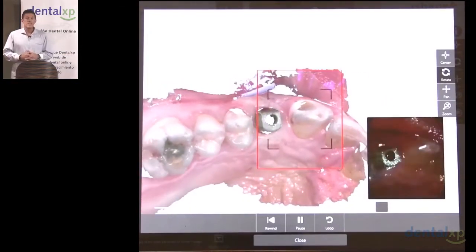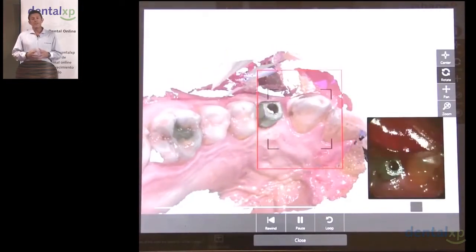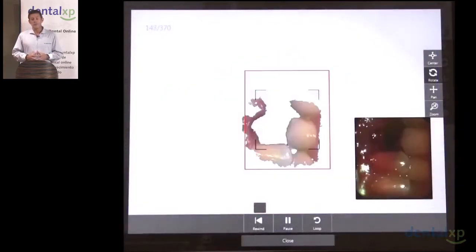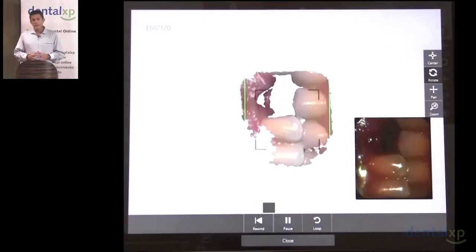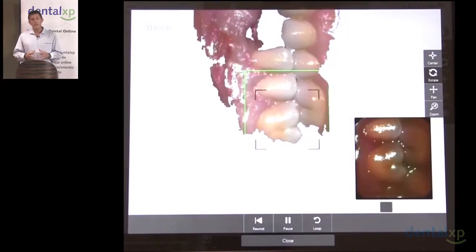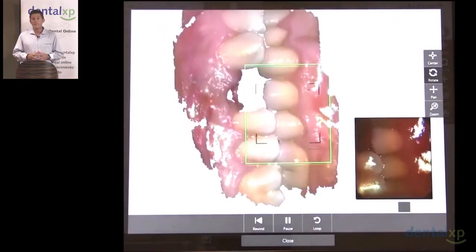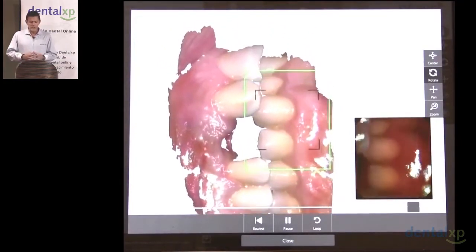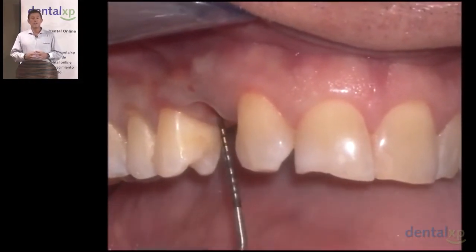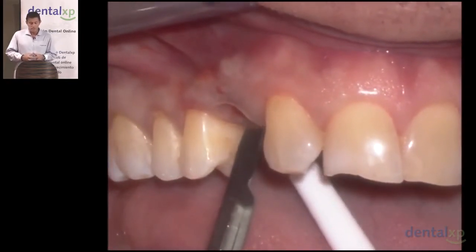Here what you're seeing is the stitching of the optical images being performed chairside the day of surgery. And you can know that we're doing this because the soft tissue has not been changed or altered at the time of surgery. We went ahead and placed the implant without changing the morphology of the soft tissue, understanding that by doing that we can send the laboratory an ideal soft tissue replica. Here what you're seeing is the bite being recognized, so we have the soft tissue, the scan body which gives them the implant positioning below the soft tissue, and of course then the bite registration.